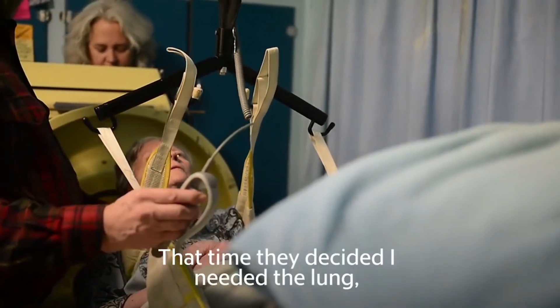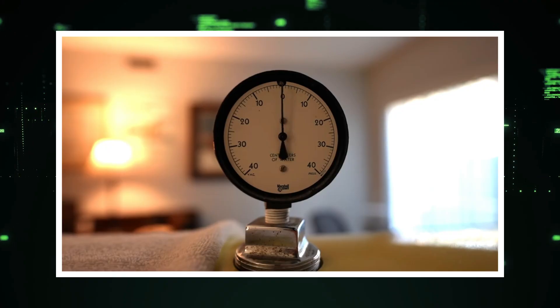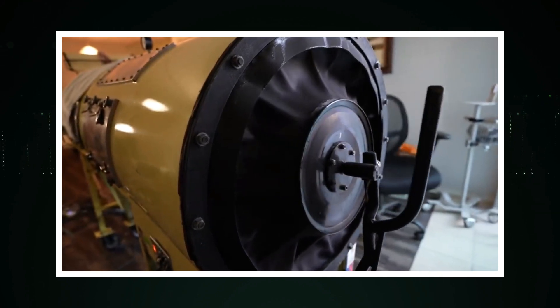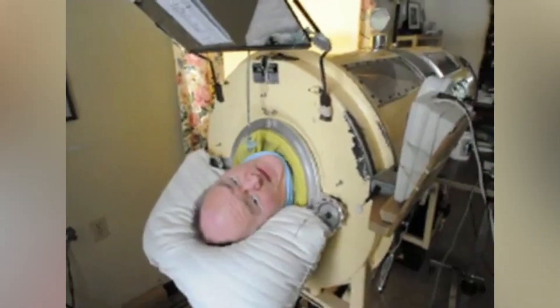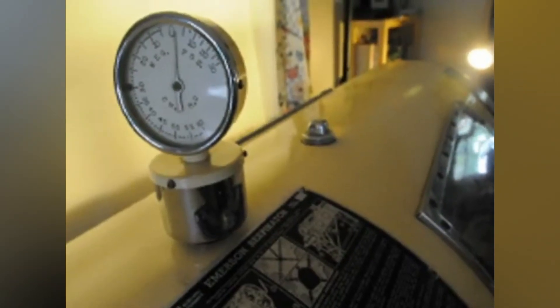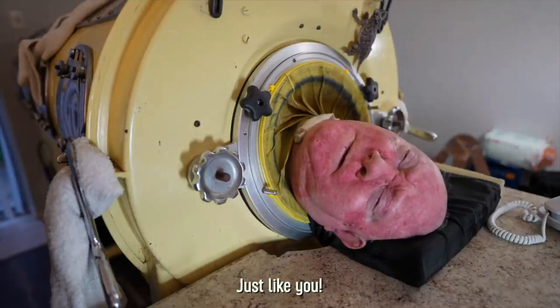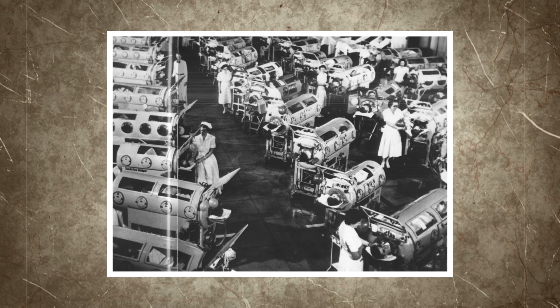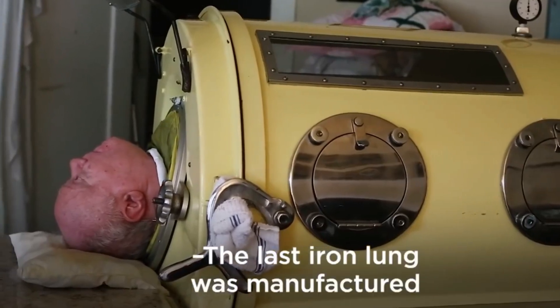When the patient was placed in the iron lung, a rubber collar would be placed around the neck to create a seal, and then the pump would be turned on, causing the pressure inside the chamber to drop and air to be drawn into the patient's lungs. When the pump was turned off, the pressure inside the chamber would return to normal, causing the patient's chest to relax and the air to be expelled from their lungs. Iron lungs were widely used in the mid-20th century to help people with polio breathe, and they were very effective at keeping patients alive.